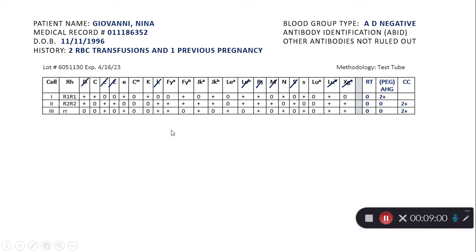Welcome back again, and we will perform our rule outs using cell 3. Little e has been ruled out, anti-Duffy A, because that cell expresses A antigen only and not the Duffy B, so it's homozygous for Duffy A. Anti-JKA, anti-Lewis A or LEA, anti-N as in Nancy, anti-little s, and that's all. So pause again here and circle or highlight or underline, however you want to mark it, what antibodies you have not ruled out. We still have a fair number.